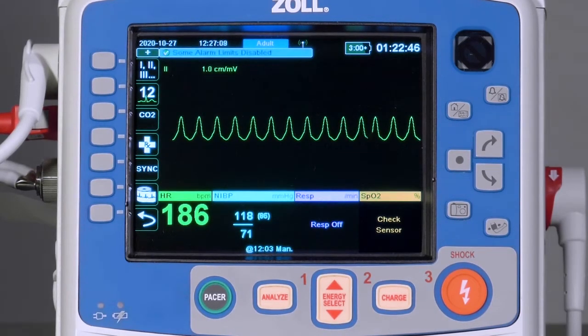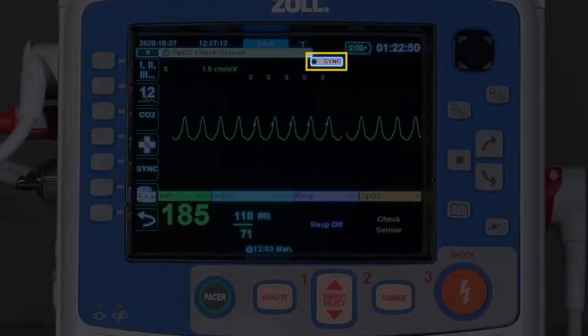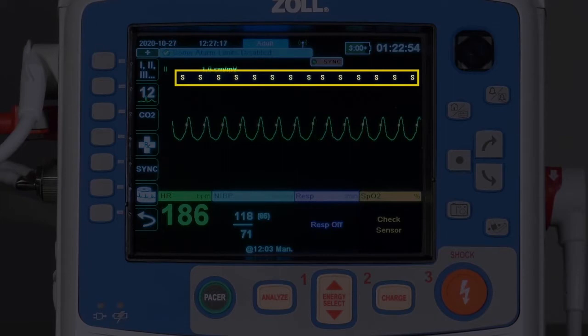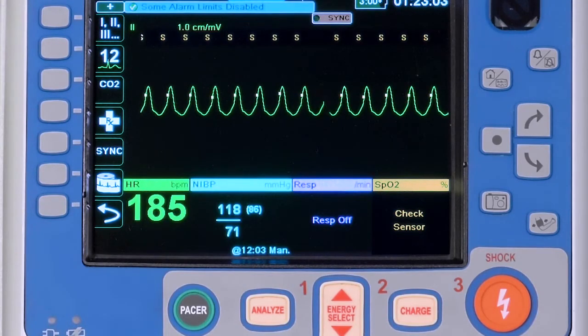When the Sync button is activated, the word Sync is displayed and is accompanied by a flashing green light at the top of the screen. Also note the yellow letter S will appear above each complex, along with a yellow marker on the R-wave.